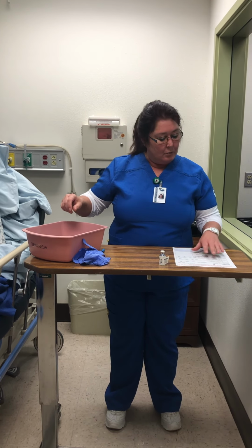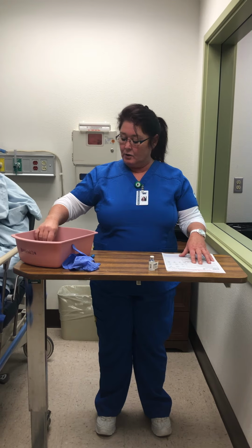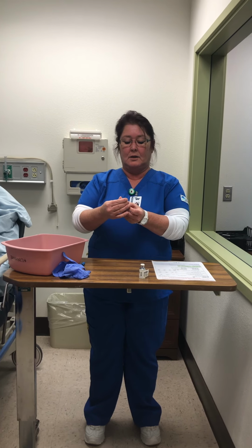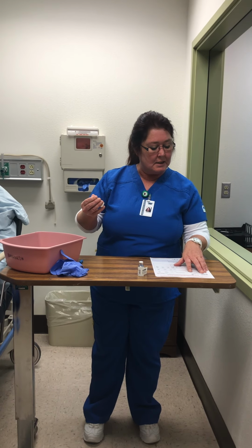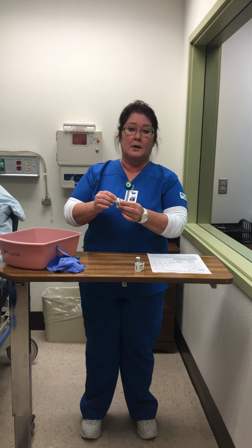I am now going to pull my Practi regular insulin U100, and it is for Shirley Cost 514.1964. And this one, we are also good on the expiration.